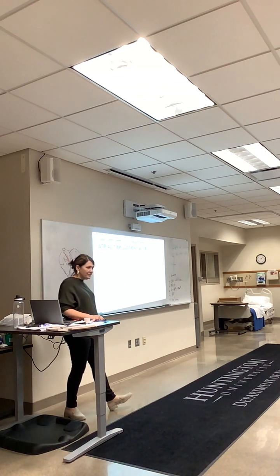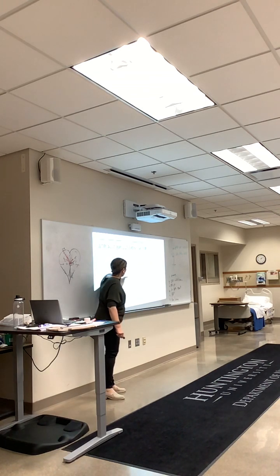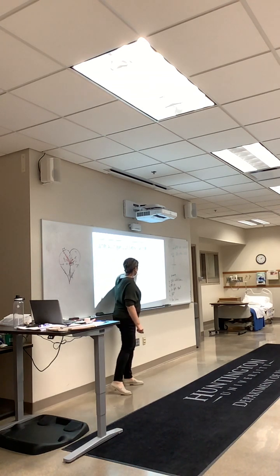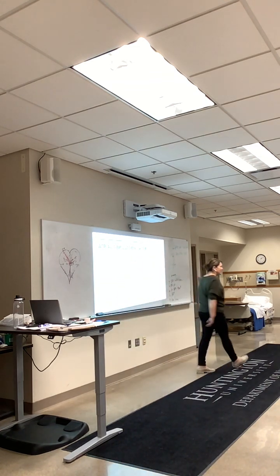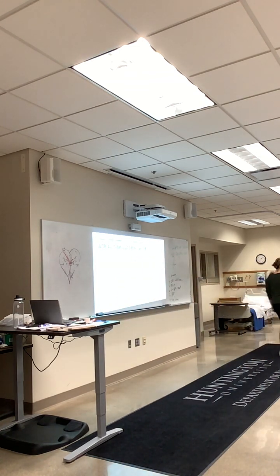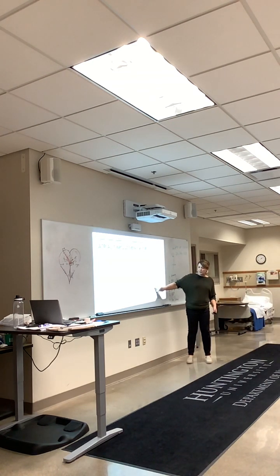Here's 2 more examples of AFib. I've got, and then I have a QRS that's narrow. Wiggle, wiggle, wiggle, QRS is narrow. This one, it's probably my T-wave here. I can guess, I can't really tell. It buries it in there. But it's all in there together. This one, okay, this is more typical of what AFib looks like.